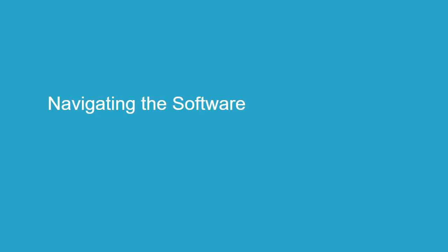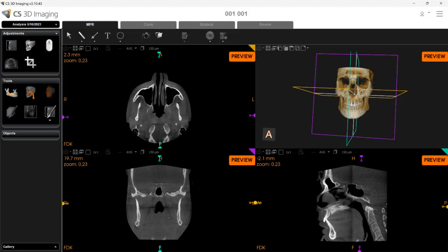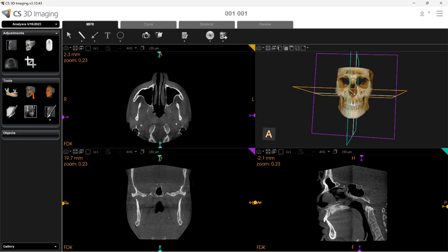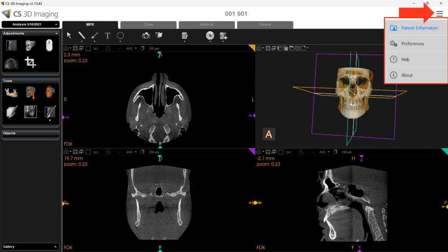Navigating the software. To open the 3D viewing software, right-click on a volume and select Open with CS3D Imaging, or double left-click the volume. As the volume opens, you may see preview labels that appear briefly. Once the preview labels are gone, you can begin navigating the volume. The patient's name is located on the main menu bar, along with the version of the software, the Implant Library Management drop-down, and the main menu drop-down containing patient information, preferences, and access to the help and software information.